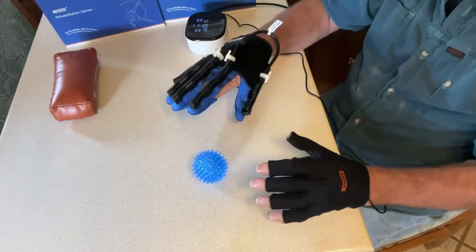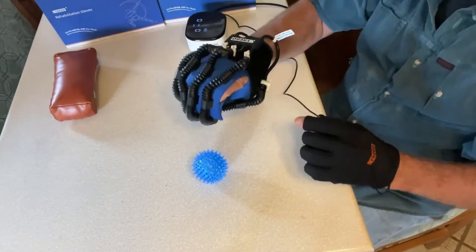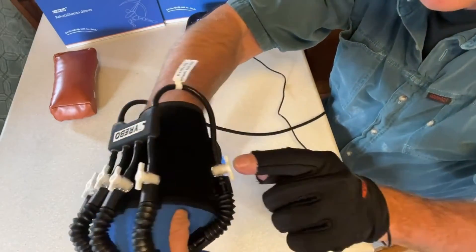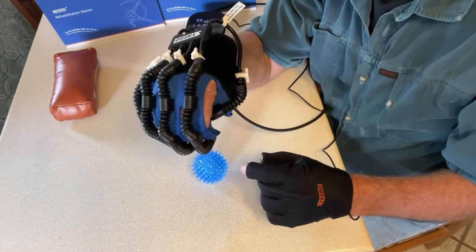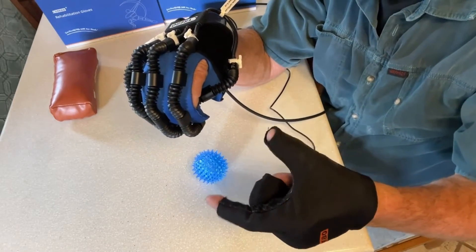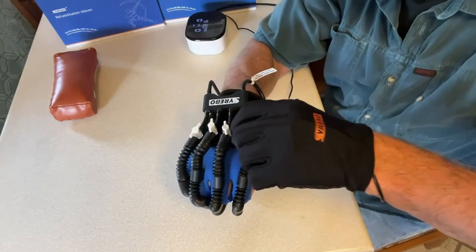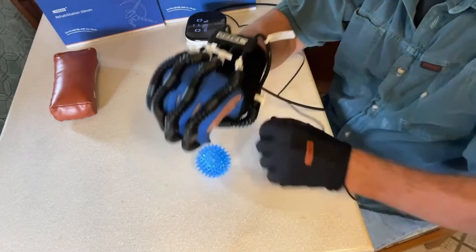Now there's another thing about this — let me shut this off. These valves back here control the fingers and the thumb individually. So if I wanted to practice pinching like this, I would shut the valves off for these three fingers. Now let's see what happens.